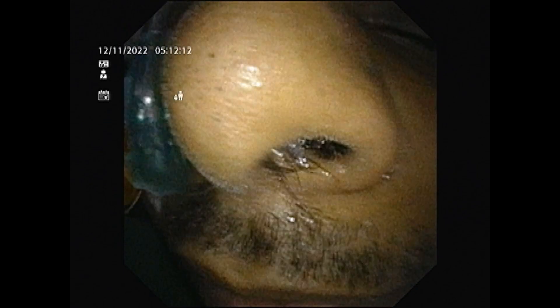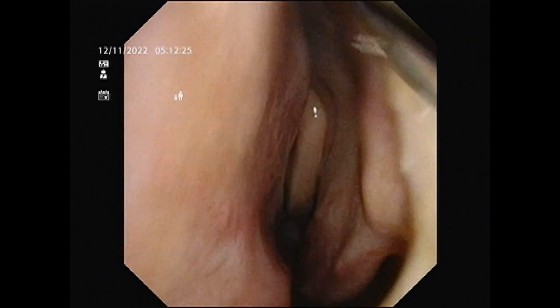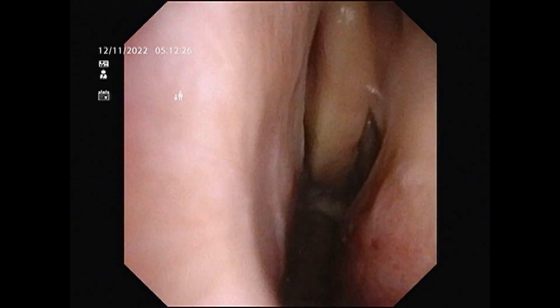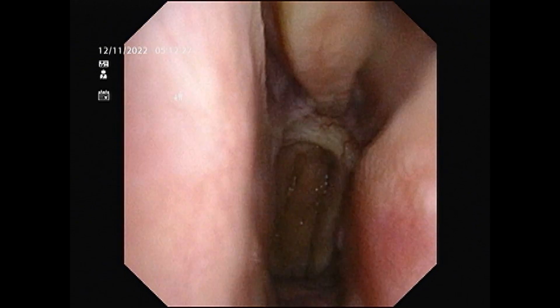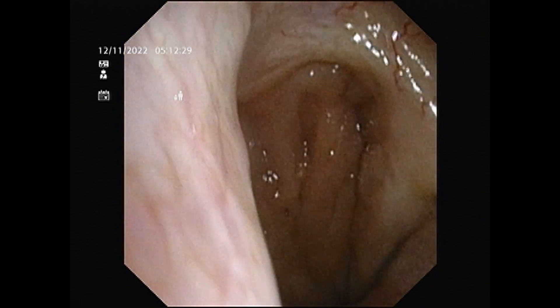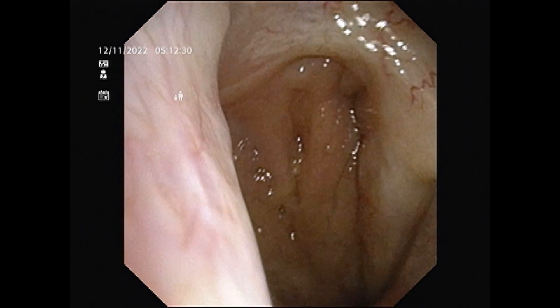Now what you can see is the patient is completely under the effect of anesthesia. To begin with, the patient undergoes mild anesthesia. What you can see on the screen is the flexible bronchoscopic unit which I use to do the DICE procedure. This is the patient's left nasal cavity going straight inside with the flexible camera.